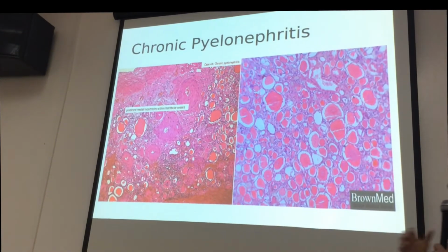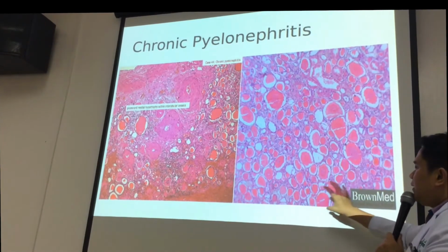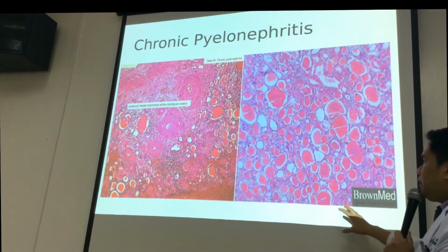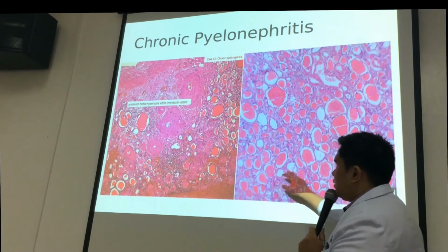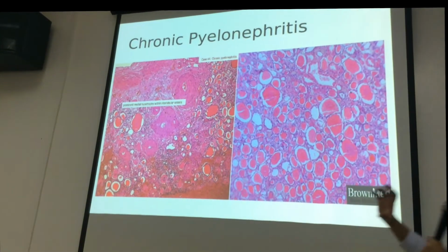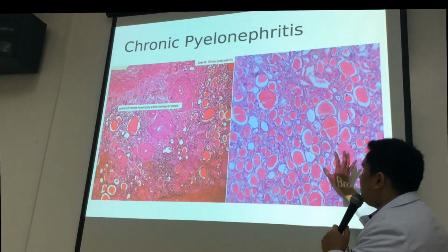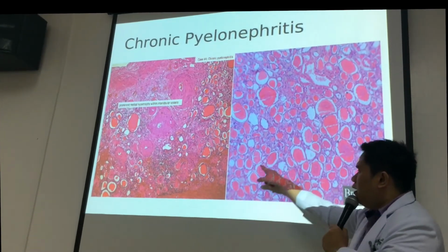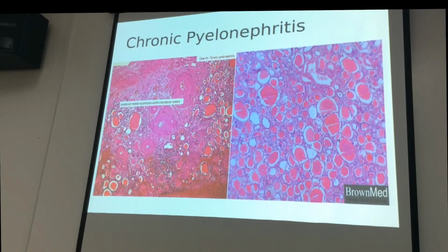So as I've said, when some parts of the renal tubules undergo necrosis and are later replaced by fibrous connective tissue, it will contract. Normally, these are actually your renal tubules. Normally, your renal tubules are elongated, diba? But because of contraction, they become ovoid or circular. And because of the ensuing inflammation that is still present in this organ, it will also cause atrophy of the renal tubular cells lining the individual renal tubules.